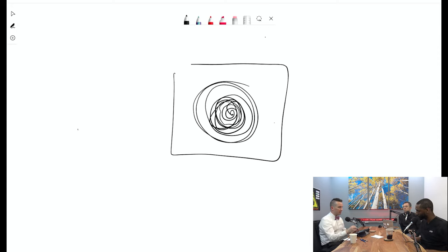Yep. And so I would much rather wait for the contrast to be close to or completely opacified to hit start, rather than, if I'm filling the old way, hoping that when I'm filling the center of k-space the carotid is opacified. There are too many variables there. So with the elliptical centric k-space, you're taking away more variables specific to a patient. There's also the test bolus that you can do.